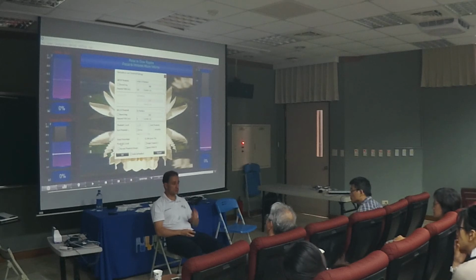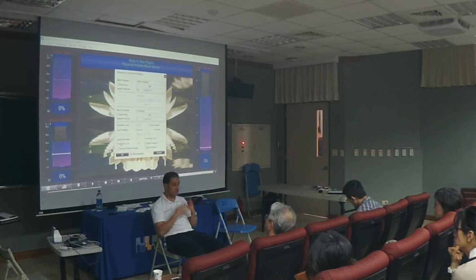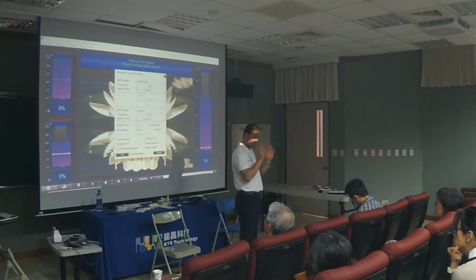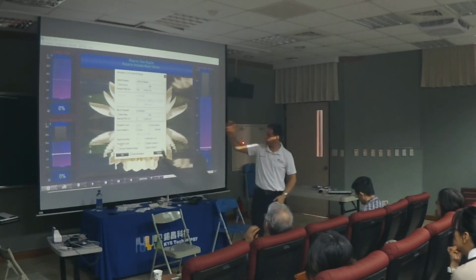It's important for 2 reasons. One, it helps you set up the threshold for the session. And 2, it's going to tell you if the brain is getting better. Because let's say you're interested in the theta, and if during the baseline the theta is dropping, it means the training is being successful. So it's good for those 2 reasons. So always do a 1 minute, 1.5 minute baseline before every session. Okay. At first you're going to forget again. It takes time to remember these things. So you sit the client down, 1.5 minute baseline, and we start training.